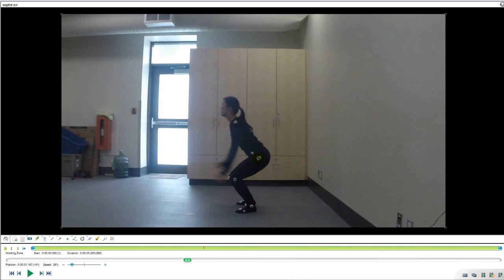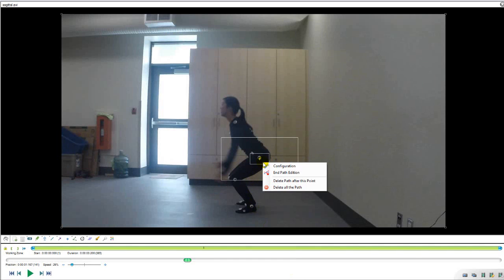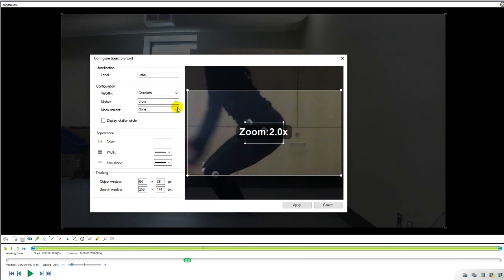To track the marker, right click on the point of interest and hit track path. Now change the object and search window to closely encompass the marker. This can be done by right clicking the track path and going to the configuration menu.